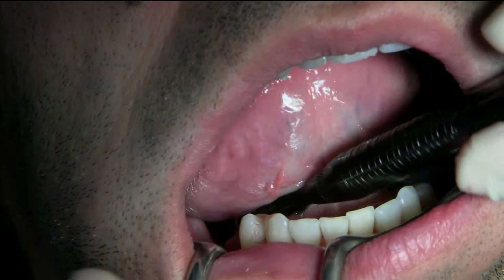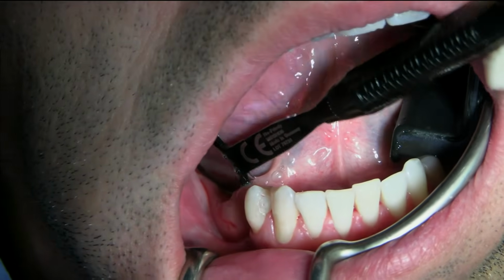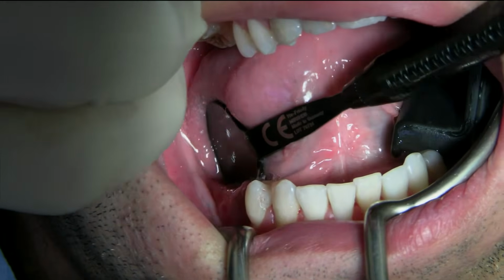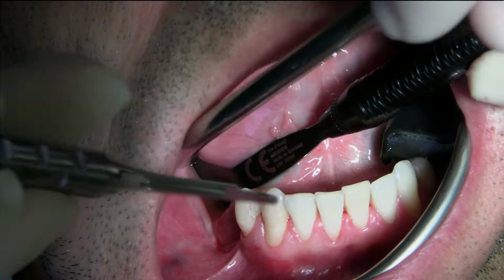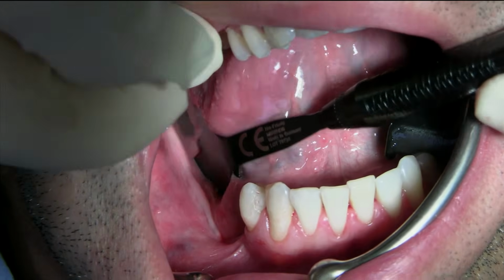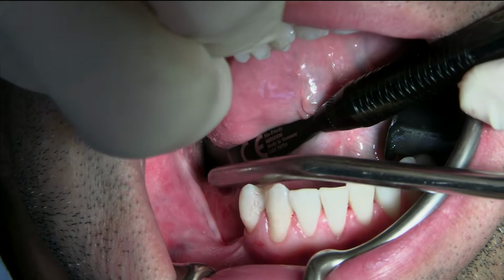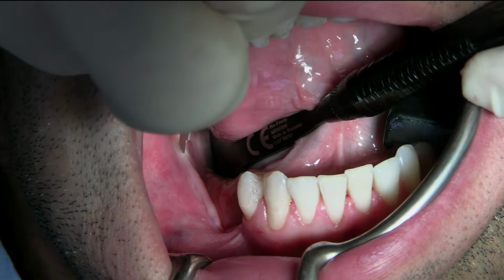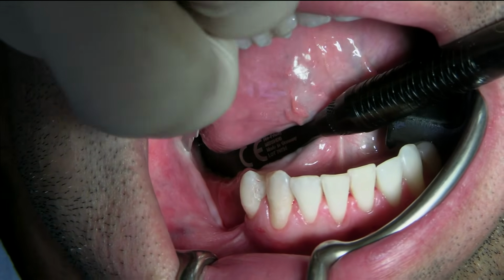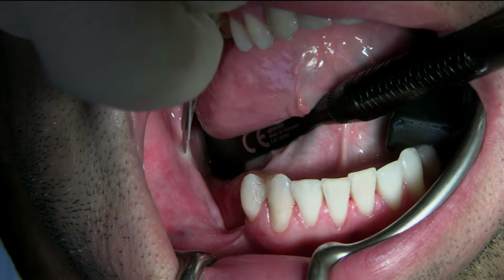So we're ready for the first start. So we'll go for the 15. And let's see how we can show that. I need some gauze here. Let me go posterior. Okay.